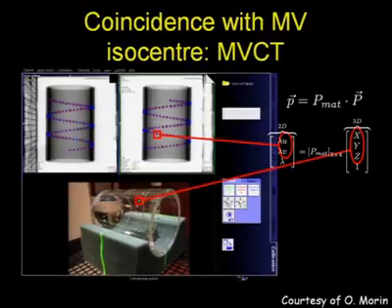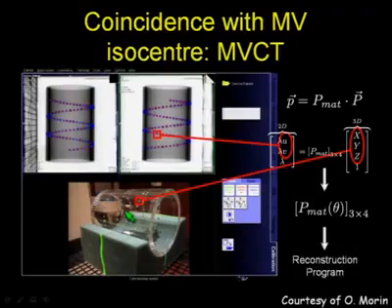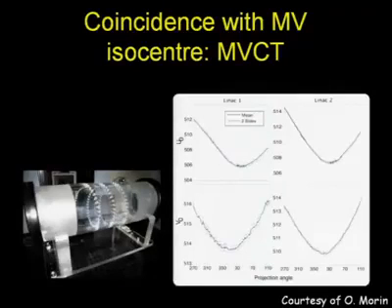using individual analysis of each of the ball bearings, they can bring a correction that can be used by the reconstruction program in order to remove all of these little errors and realign the image data set with the treatment room isocenter. And again, this method gives us some curves that are analogous to the flex map that I just described, that are characteristic of each individual system.